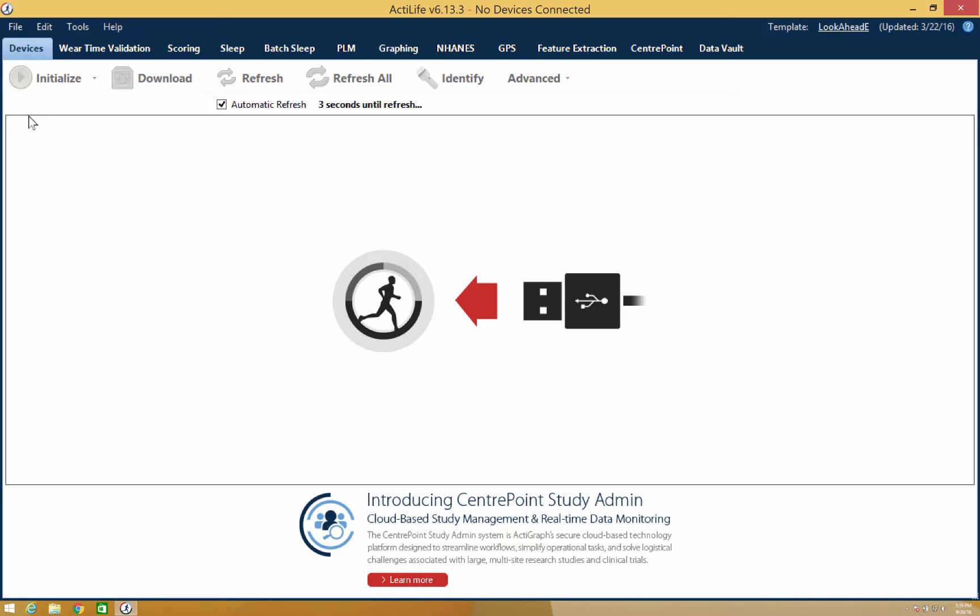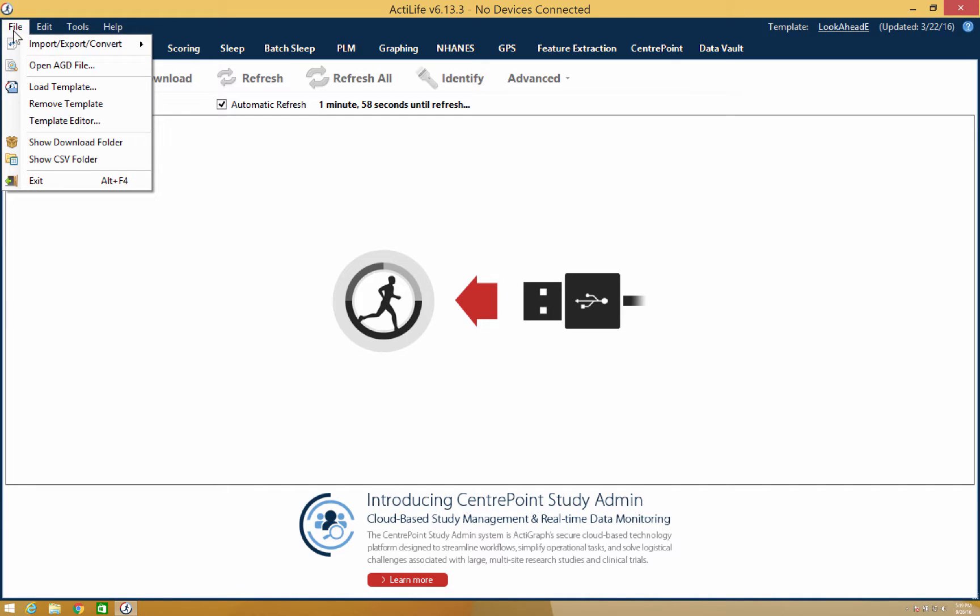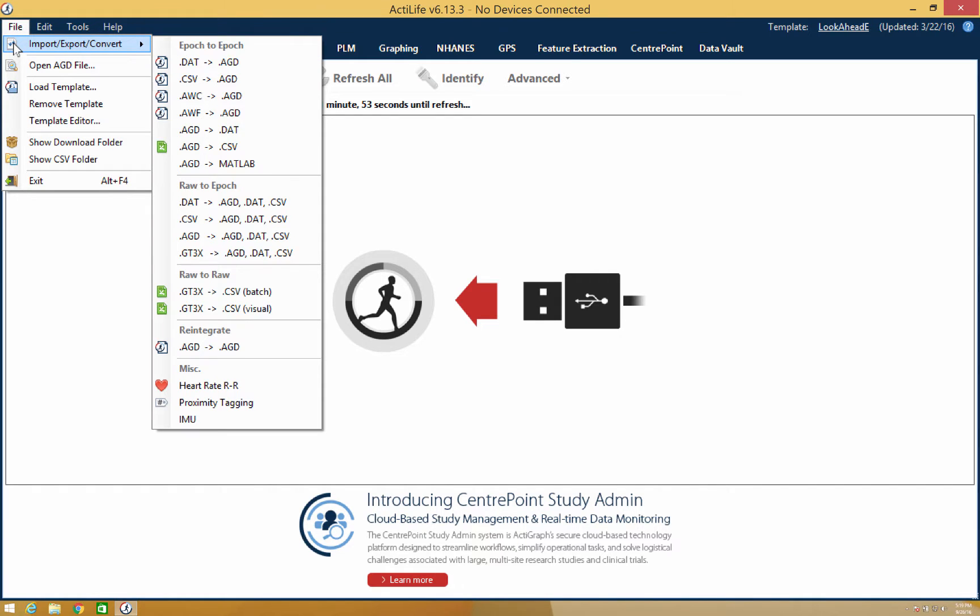We're going to begin with the file option in the software. When opening the file option, the first thing that you'll notice is Import, Export, Convert. This is where you'll be able to modify files to the format type that you need.